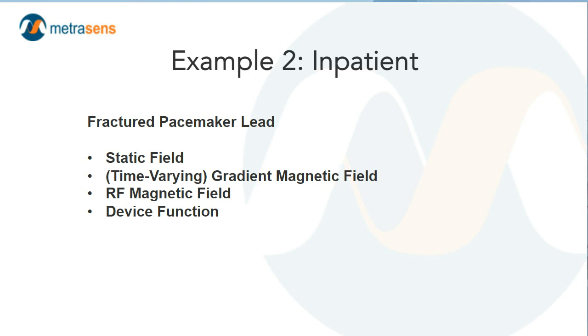I'm 6'4", which is what, 185, 190 centimeters. If we're imaging my knee, the gradient amplitude incident on the upper chest, where this abandoned lead is, is going to be very, very, very small, and in my opinion, not a safety concern. So the habitus or height of your patient will come into play on this.